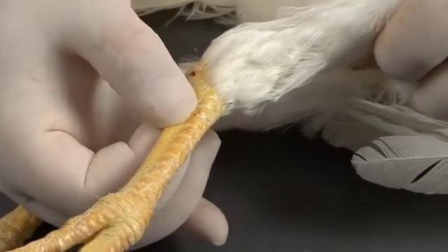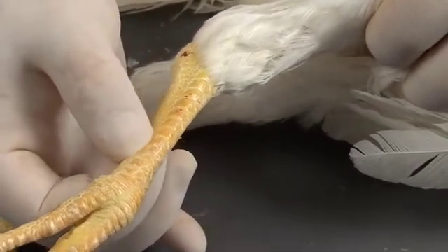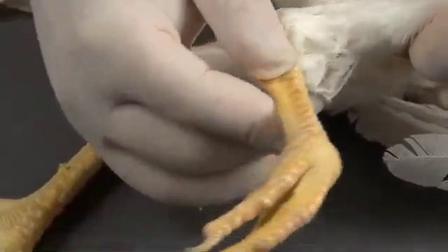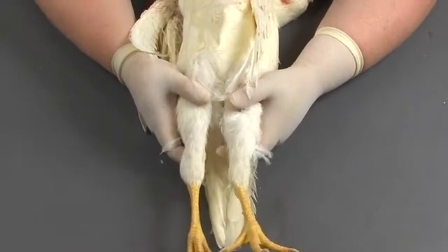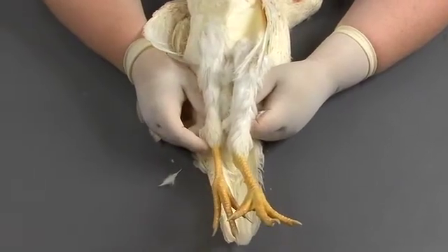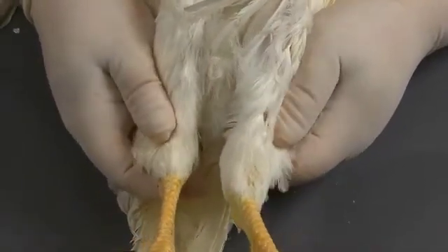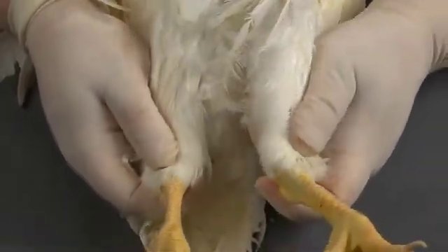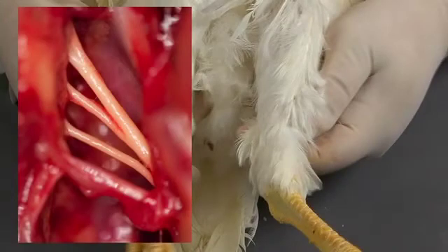Palpate the tendons. Assess them for swelling, that may be indicative of tenosynovitis, or laxity associated with tendon rupture. Examine the musculature of the legs, noting symmetry and tone. Asymmetry in size may indicate muscle atrophy, resulting from injury or damage to the nerves of the limb. Any muscle atrophy observed during the external exam will require a close inspection of the corresponding nerves during the internal exam.